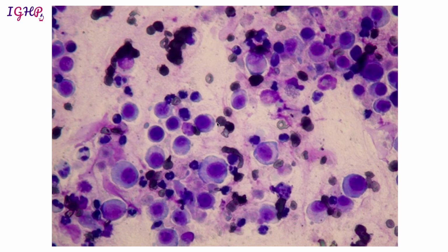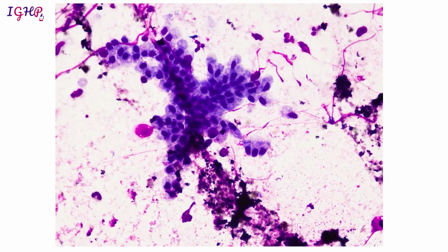But otherwise on this smear we know that it is not non-diagnostic, and the pathology that we are seeing could explain the mass in the head of the pancreas. So this is category 2, in which it is non-neoplastic, it is diagnostic, it's an inflammatory lesion which could be autoimmune pancreatitis, and you would like to do further work-up, that is IgG, IgG4, and you would like to know the serum IgG4 levels of the patient.